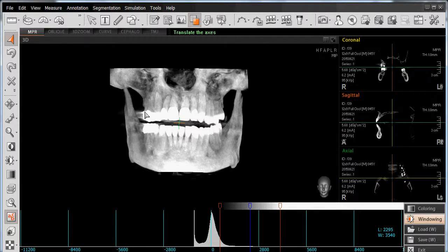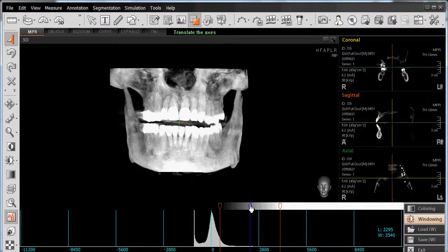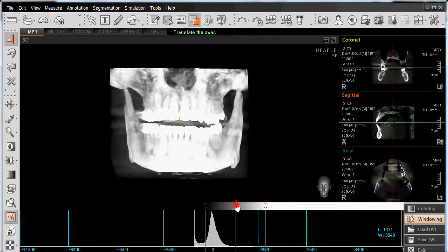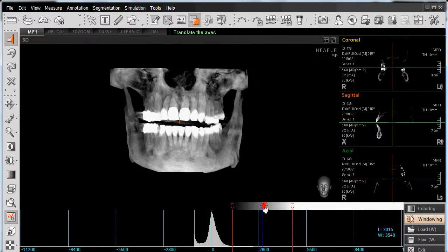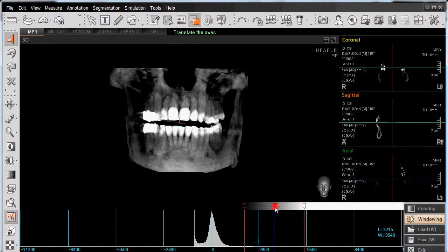I can also adjust the brightness. That's controlled by the blue line right here. As I left-click, I can slide to the left to make it brighter, or left-click and slide to the right to reduce my brightness.